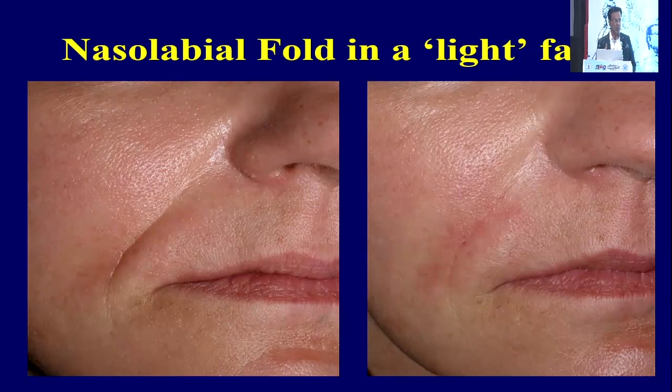Hyaluronic acid being the way it is, it will also absorb some water, so this line will completely disappear in the space of 2 weeks or so, depending on what sort of osmolarity of the thing you're using. Now let's look at this particular patient of ours.